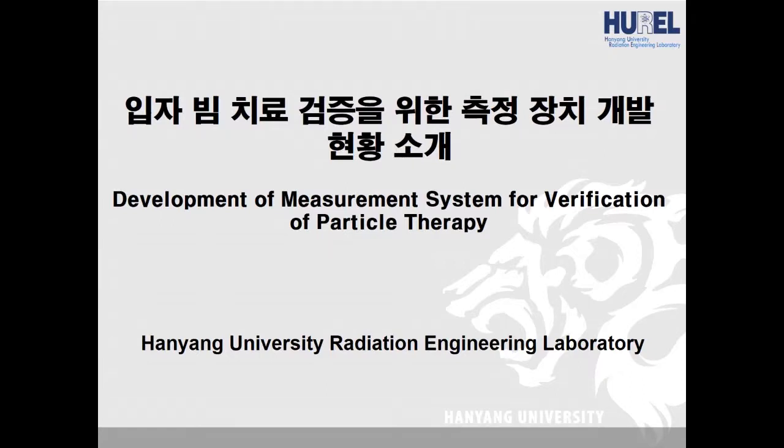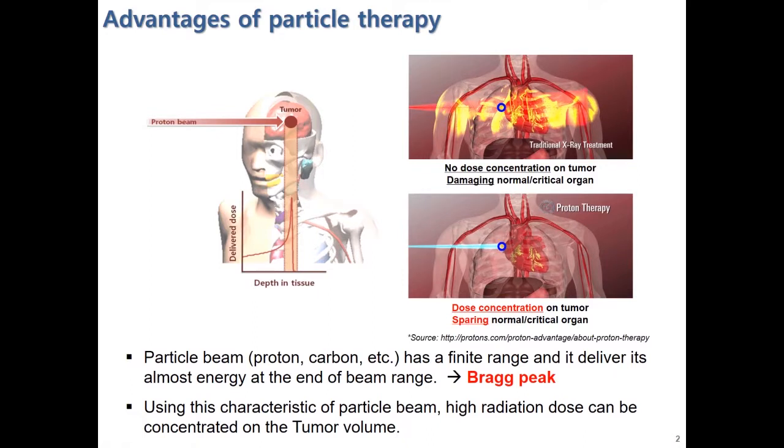This video is made to introduce our research to develop a measurement system for the verification of the particle therapy. Compared to the conventional radiotherapy, the particle therapy using proton or carbon beam has many advantages.